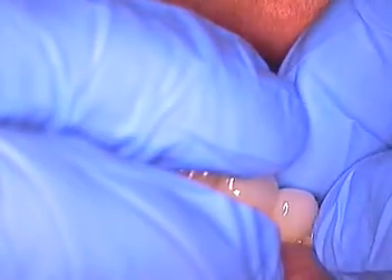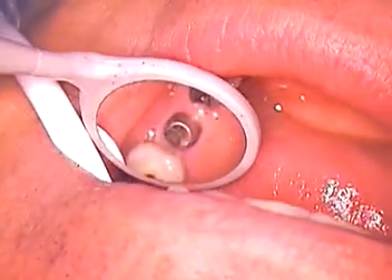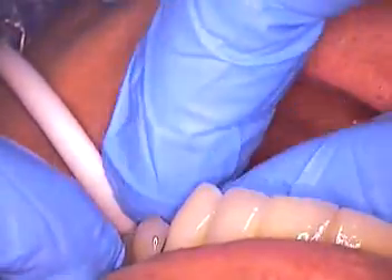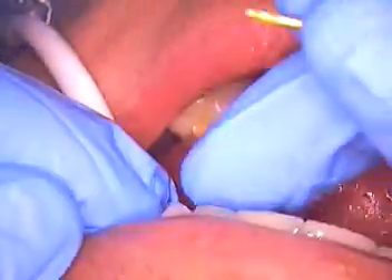So we're coming back to this side now. I'm going to take these out so we don't fumble. Going together — they're going down the aisle together. They bottom out perfectly. So back on this side — we've checked the distal contact on 13, correct? Double check it. We fiddled with this one to make sure we had a good contact. So I'll double check it. Good. I've bottomed out.